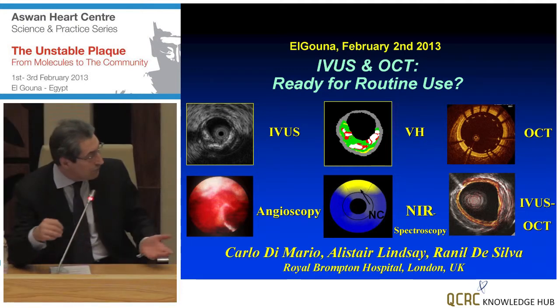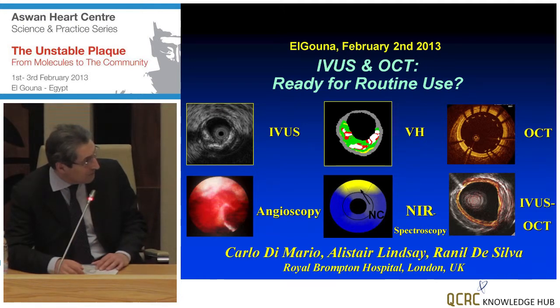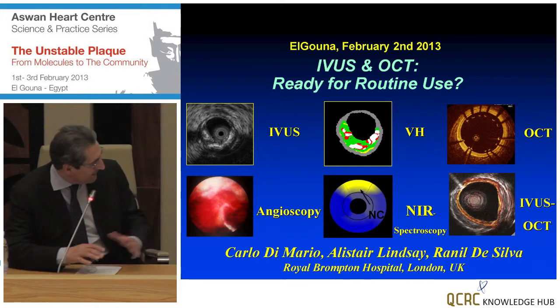Well, more than inflammation, the holy grail is to show cholesterol in a quantitative fashion. What is somewhat missing, for somebody who is used to images rather than a yes-no answer, is where the cholesterol and the lipids are located within the plaque, because thickness of the cap obviously has a role, and whether this is uniformly distributed or is in a core with the potential of rupture may make a tremendous difference.